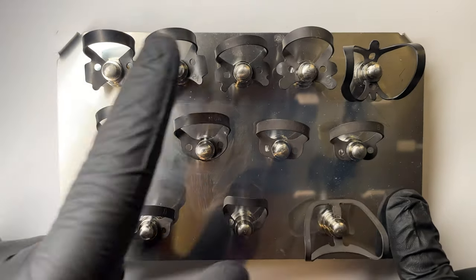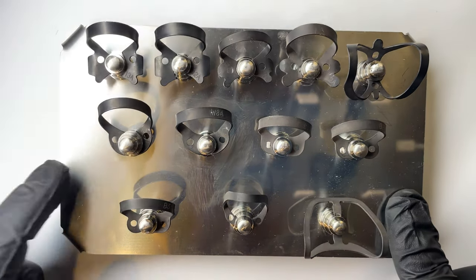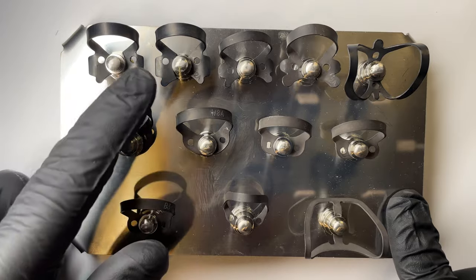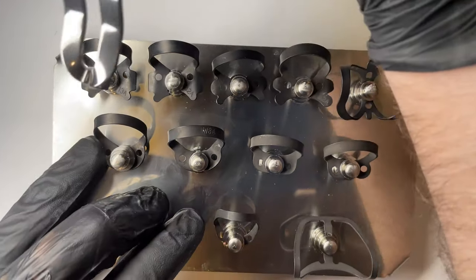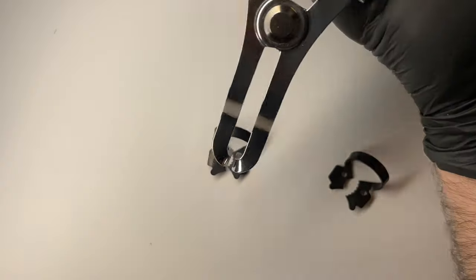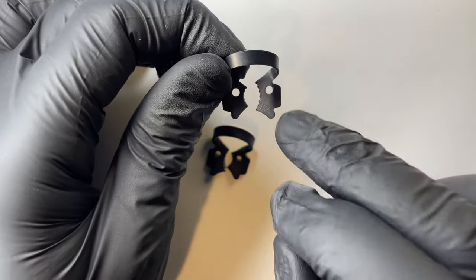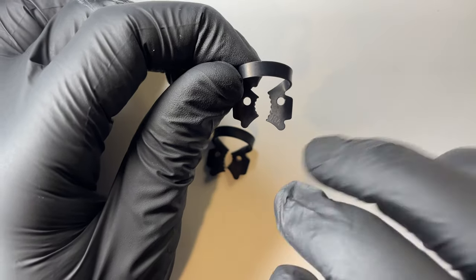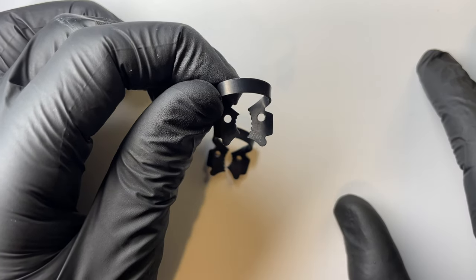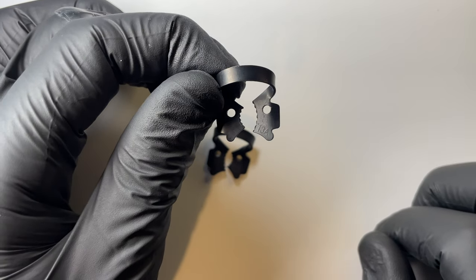I'm going to start with the wing clamps we have in the kit. The two molar ones are really our workhorse wing clamps — the 13A and the 12A. The reason we really love these clamps is that they have serrations on them, and that allows them to clamp a really wide range of different teeth: broken down teeth, big teeth, small teeth. They'll do a lot of 6s, 7s, 8s.